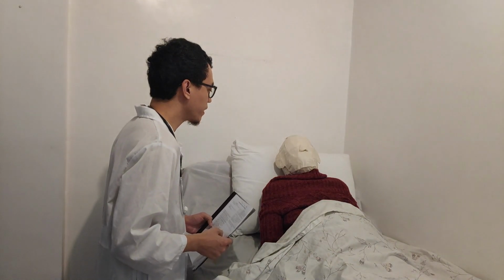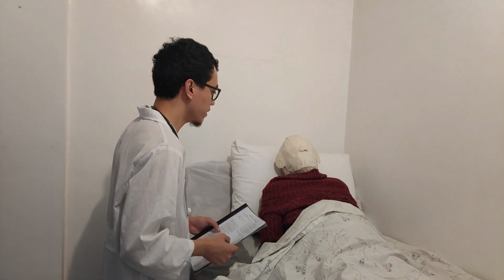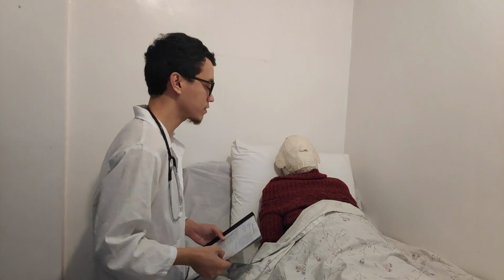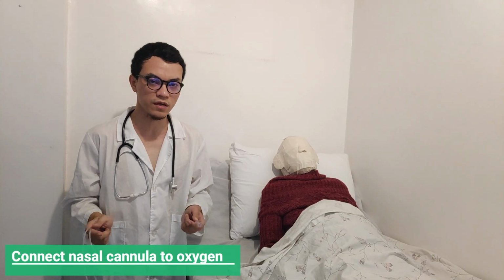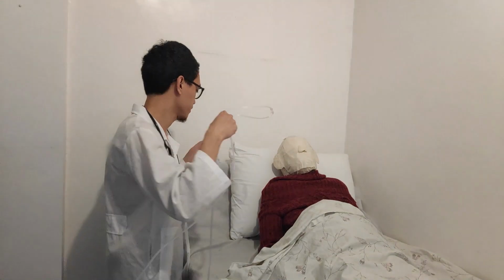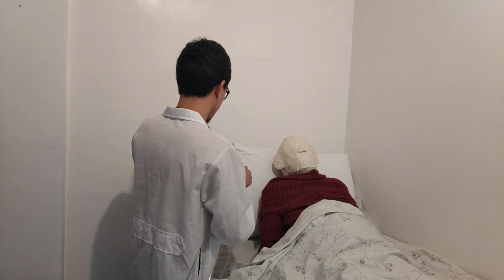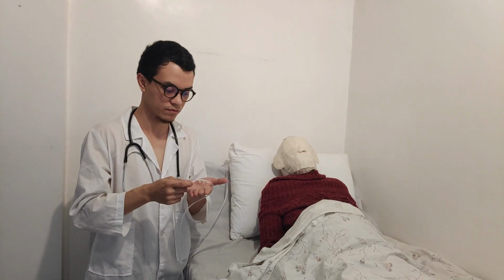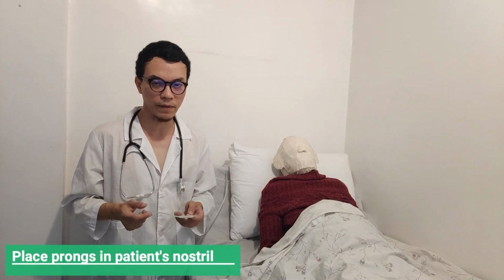Mrs. Santos, I will be administering oxygen by nasal cannula, so this will help you breathe normally, okay? Thank you so much. Next is connect the nasal cannula to the oxygen setup with humidification and then adjust the flow rate as prescribed. Check the oxygen if flowing out of the prongs. Next is place the prongs in the patient's nostril.